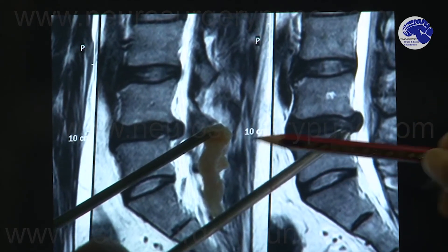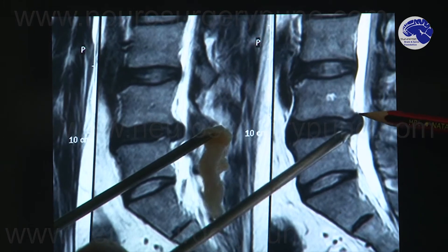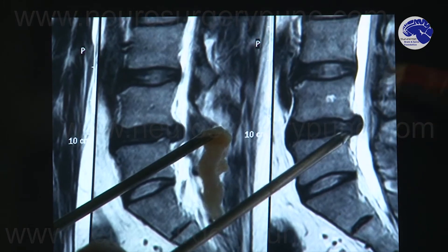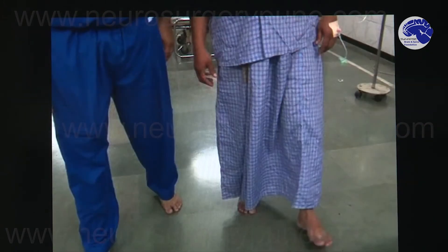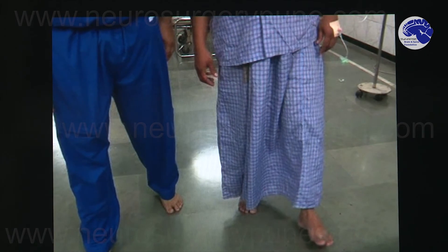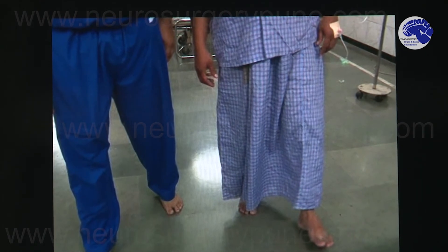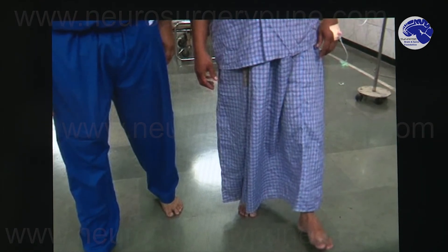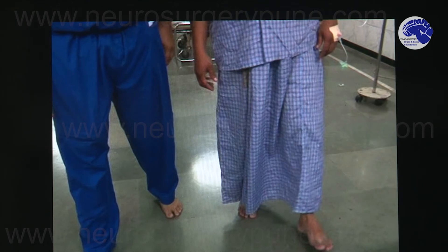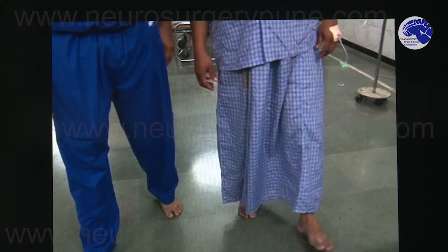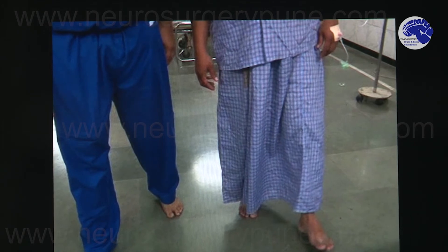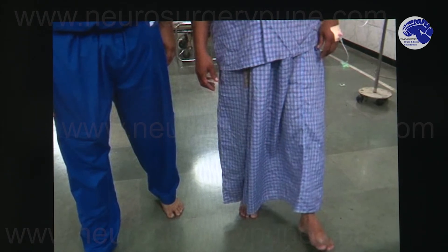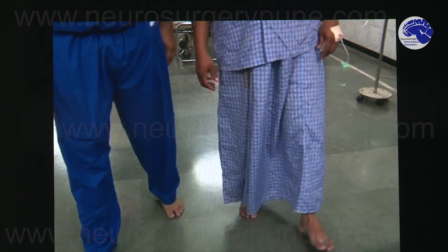You can see this white fragment here along with the corresponding pre-operative MRI picture. After the surgery he was made to walk within 30 minutes and was completely pain-free. It is now more than five years after his surgery and he is still completely pain-free — in his case endoscopic discectomy was certainly very successful.